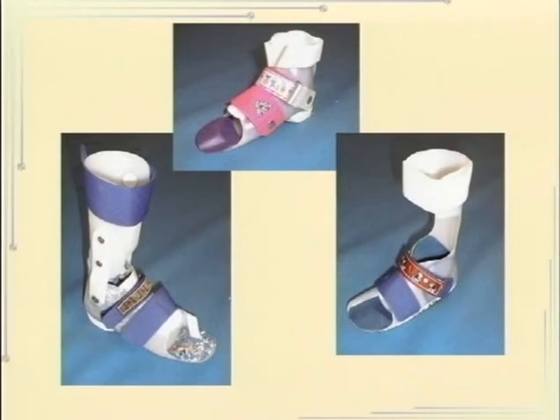So this feature, this one small feature, which really you didn't see in the pre-DAFO era, I think was a small change in design, but it made a lot of sense, and someone started figuring it out that let's have this extra piece of plastic that wraps on the top, and then put the straps across that to seat the hindfoot or the heel well down in the DAFO, so you're not always popping up out of them, and that had been a problem earlier.